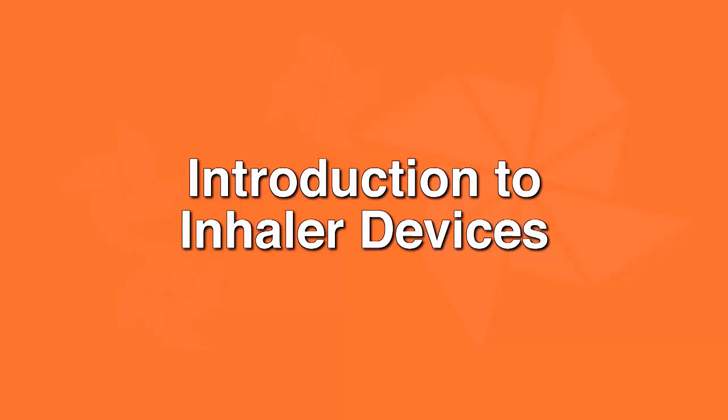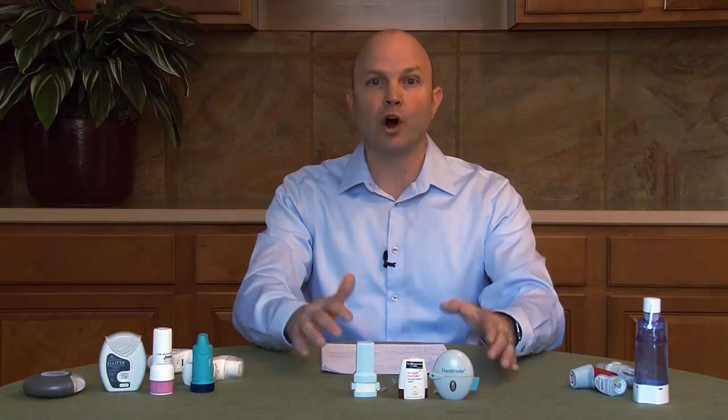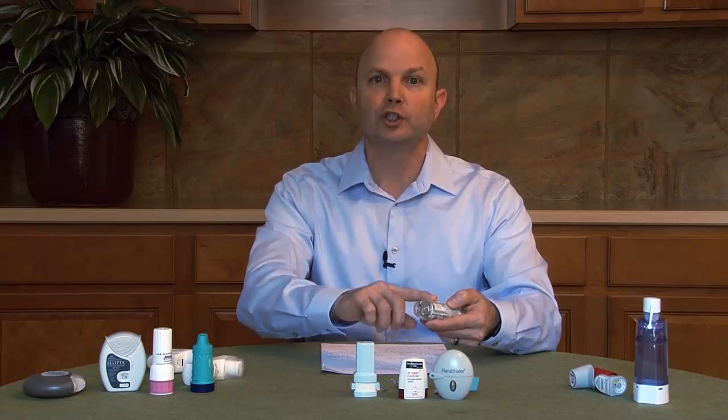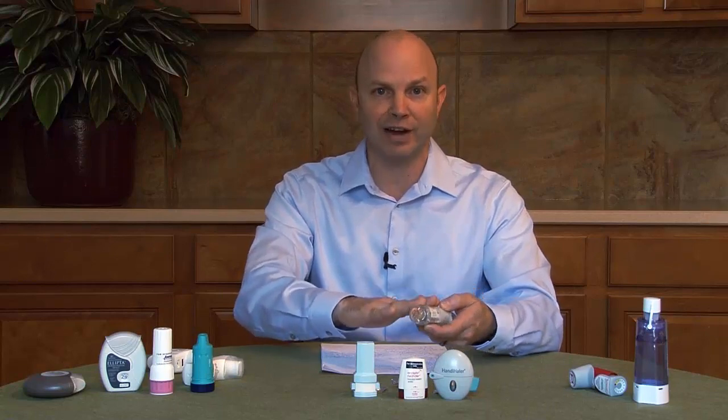This is an introduction to inhaler devices. Just like your medications, there's a lot of different ones available, and there's almost as many different devices as there are medications. But you will notice that a few devices are used for multiple medications. So make sure you refer to your medication list to see what medicines go into each of these inhaler devices.